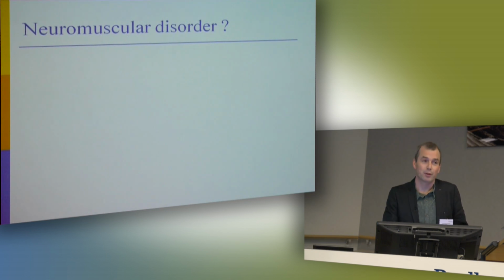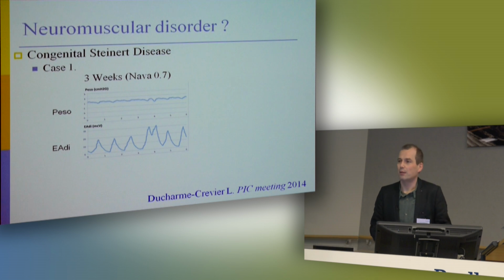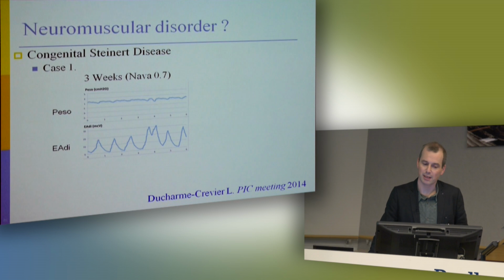One very important thing to consider is if the patient has a neuromuscular disease, and you cannot assume that the EAdi is the same in this patient. It's important, and this case makes me realize that aspect.